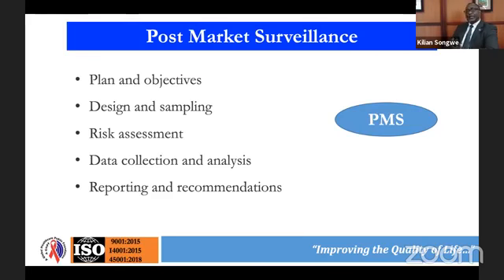When we talk about risk and risk assessment, what the standard is basically saying is, what are your opportunities for improvement? So it's the opportunities for improvement, the OFI, as most people are going to come to know it in the industry. OFI is very crucial in ensuring that you run a management system that allows you to continue to give reliable and quality results going forward.